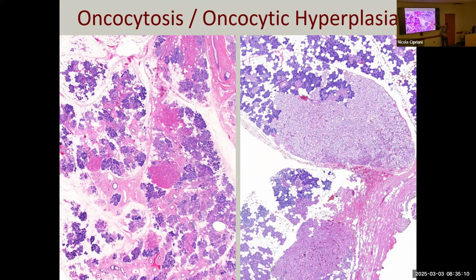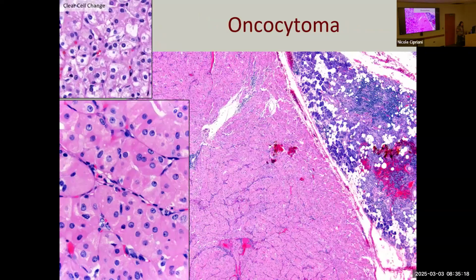And then some of these oncocytic nodules can maybe have a neoplastic transformation or just grow to a large size, in which case they become a dominant nodule, right? And they can now be referred to as an oncocytoma. As you can see, it's essentially solid and trabeculated oncocytes without any lymphoid stroma.